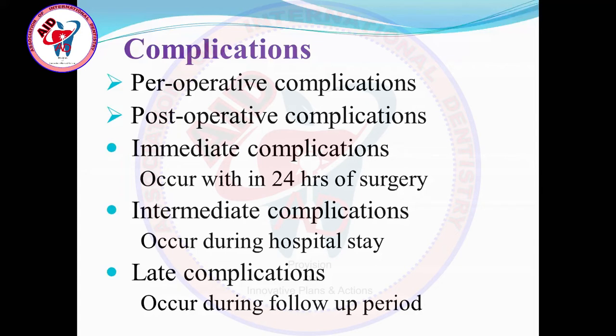Okay, then breakage of the tip of the drill bit you use to drill for the holes, or breakage of the tip of the fissure bur could be there while drilling. Then too much soft tissue damage. Sometimes during continuous surgery with the use of the drill, it becomes hot, and if you have not retracted the soft tissue properly, there could be damage to the soft tissue also with that hot handpiece, burning of the soft tissue.